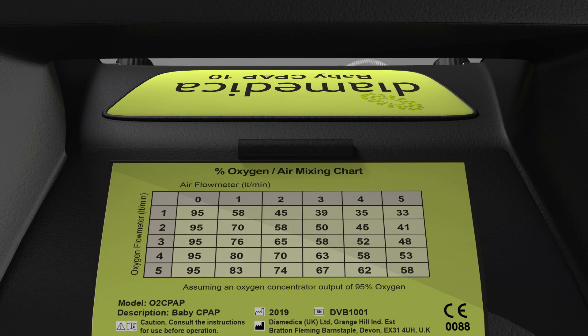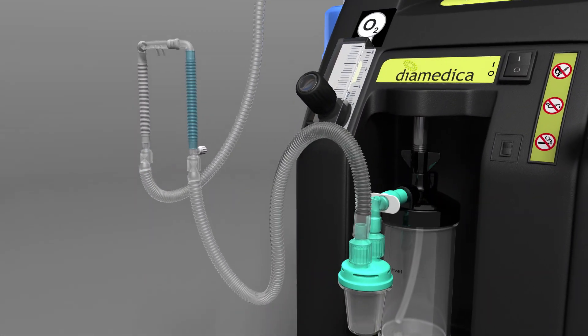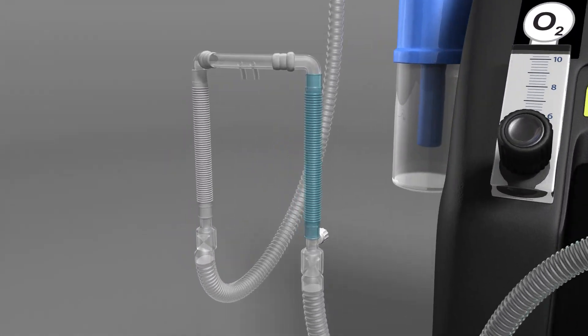The CPAP 10, designed for neonates, produces a maximum of 5 litres per minute of oxygen and 5 litres per minute of air. The gas mixture is warmed and humidified before delivery to the patient through a binasal cannula.